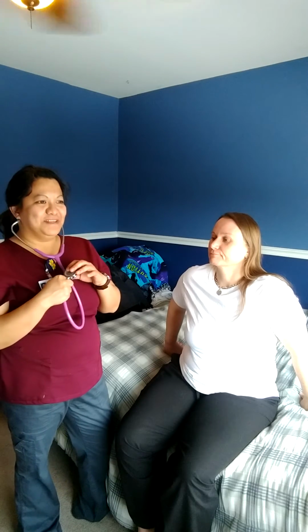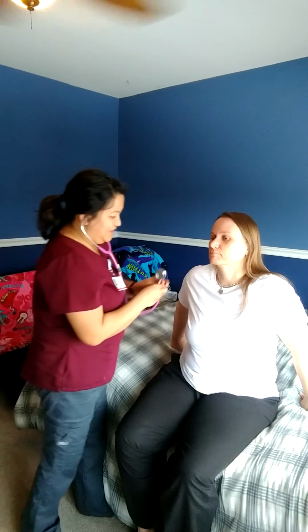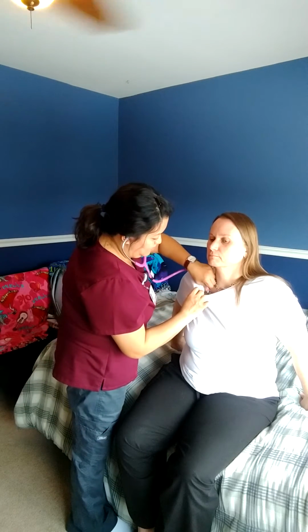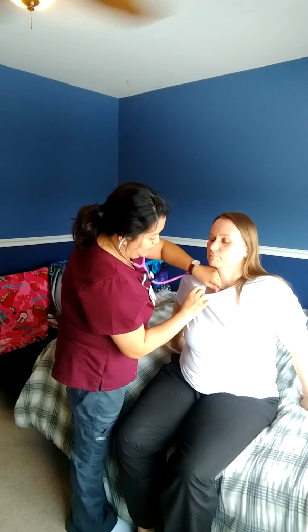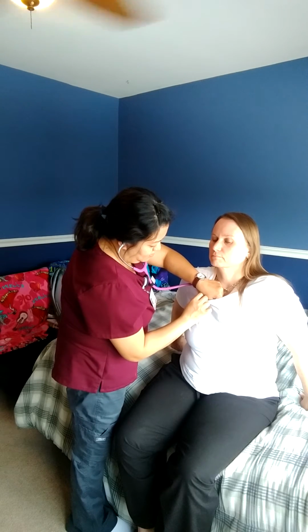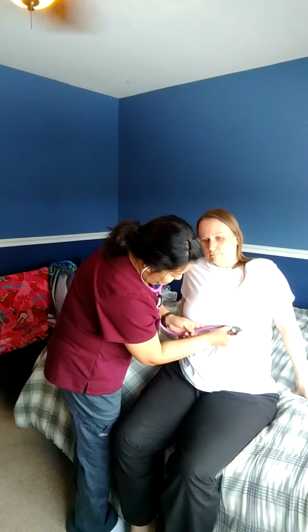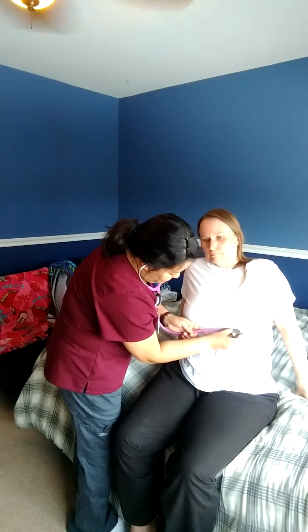I'm going to use the diaphragm for high pitch sound, and the bell side is for low pitch sound, such as if the patient has murmurs or other abnormal heart sounds. Okay, I heard the S1 and S2.